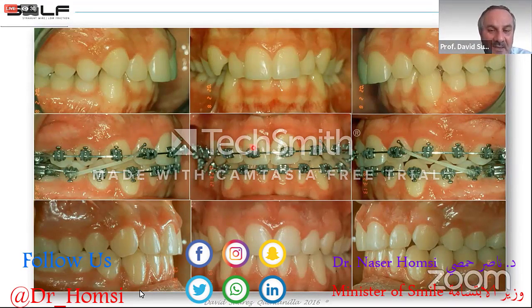In the technique we combine, in the anterior incisors, ligation in a figure of 8 to cross, to increase the torque and control the torque during the retraction of the upper incisors. The canines and premolars are ligated in the center to get a very good sliding of the wire and move the wire to the back.